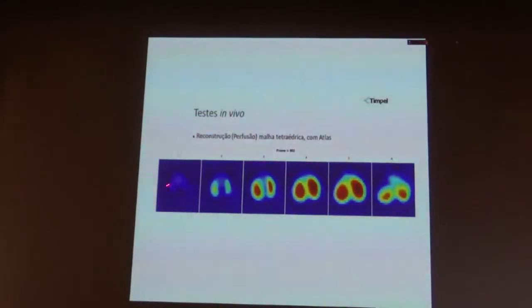So I think this is the future. We can see upper lung, so apex to the very caudal one with just one single belt. And then we can much more estimate cardiac output and the changes and the blockage of ventilation in specific areas of the lung. This is a nice example.